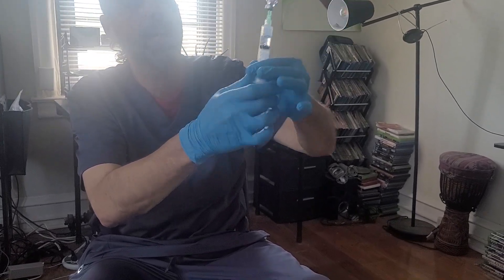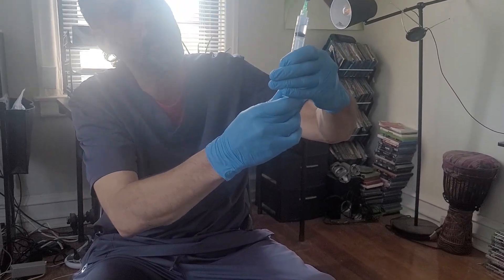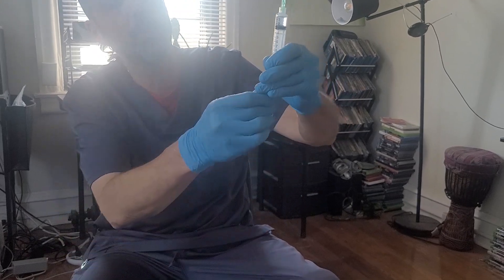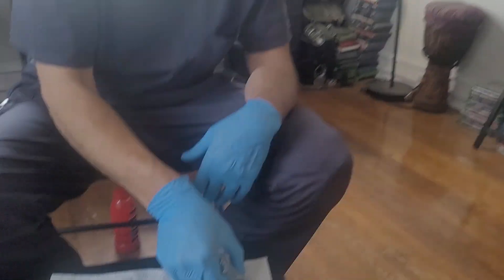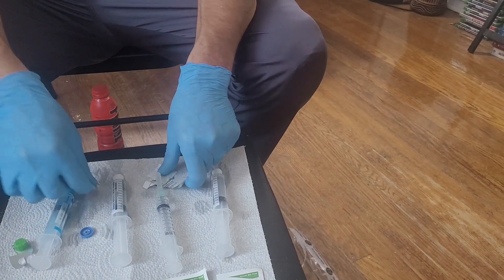Push the vial down, give it a flick — that brings the air to the top — then push back until you're at your two milliliters. Once you're there, remove the syringe, and with one hand scoop that cap up and place it back on.